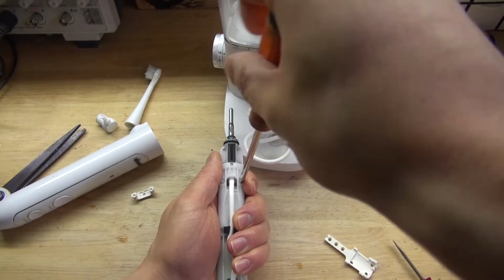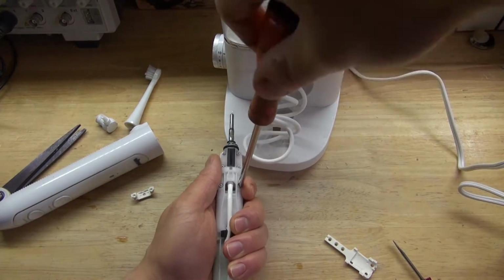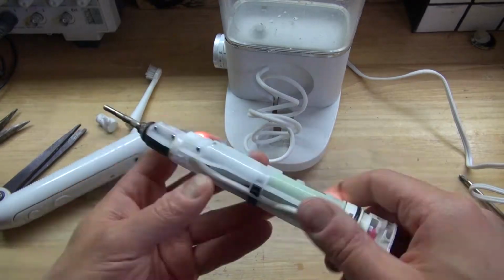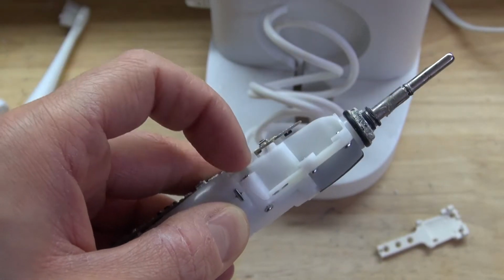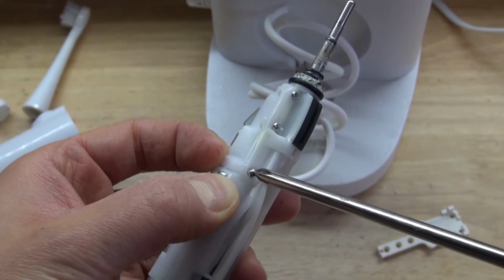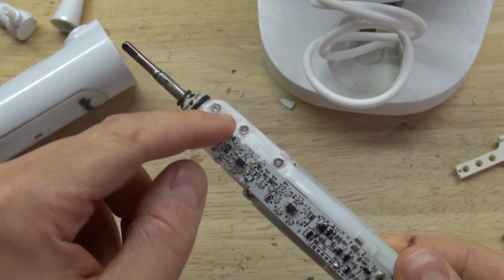Okay, so now what I'm going to do is do what I always do. See a screw, take a screw, see a screw, take a screw, and remove all the screws that I can find. All I have to do is push this nut inside, and that will hold the nut in place and unscrew the screw. Push it down, just like this. And there, all the screws are now removed.